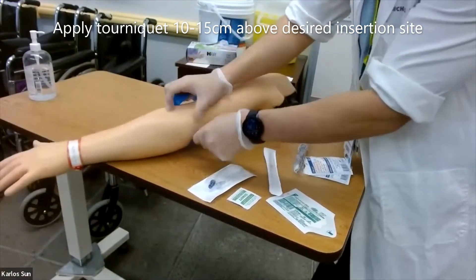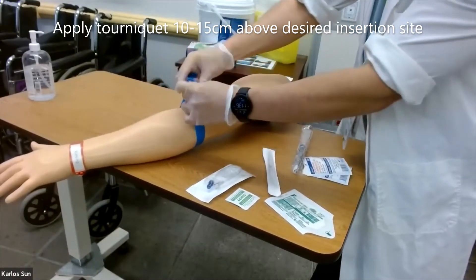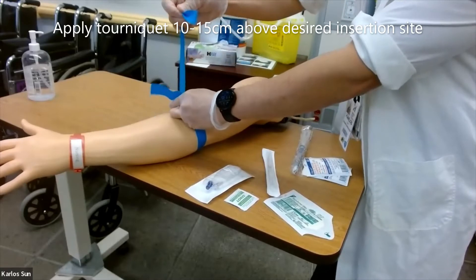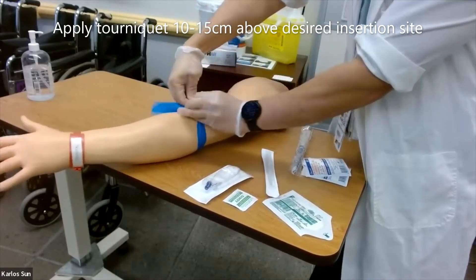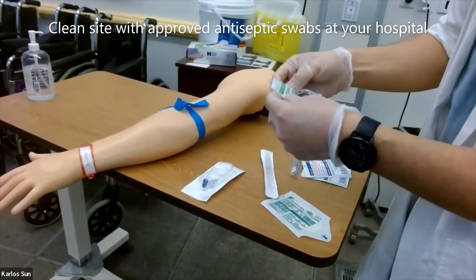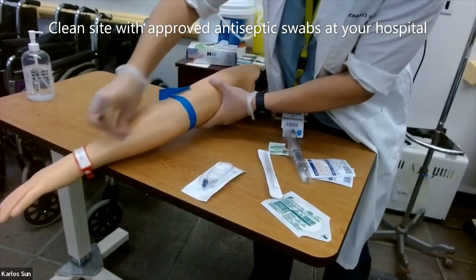Apply tourniquet 10 to 15 centimeters above the desired insertion site. Clean the site with approved antiseptic swabs at your hospital.